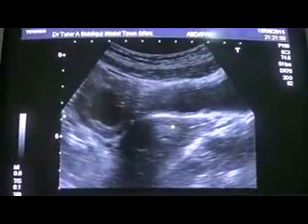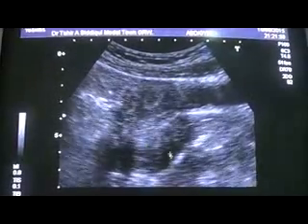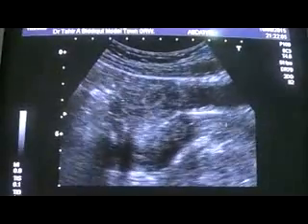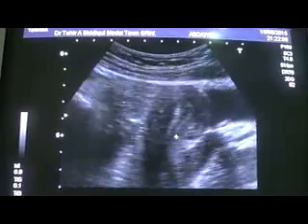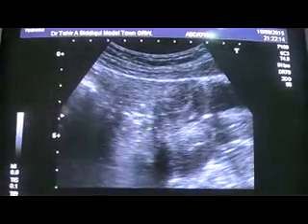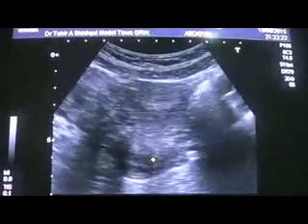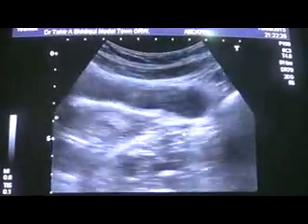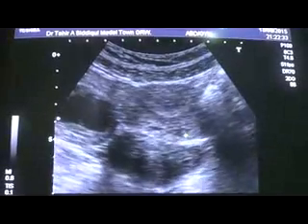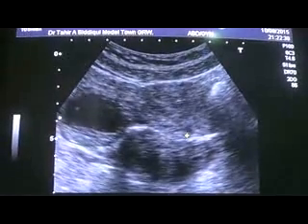These are the vaginal echoes, and it is being shared by both this uterus number 1 as well as this uterus. See, now you see this is uterus number 1, this is uterus number 2. Both are sharing the same vagina, and so far as the cervix is concerned, the cervix is also being shared by both of them. This is the cervix relating to this uterus as well as the other uterus. So we do not see two separate cervices: one vagina, one cervix, two uterine bodies is the ultimate conclusion. And this is our case of the day. Thank you very much.